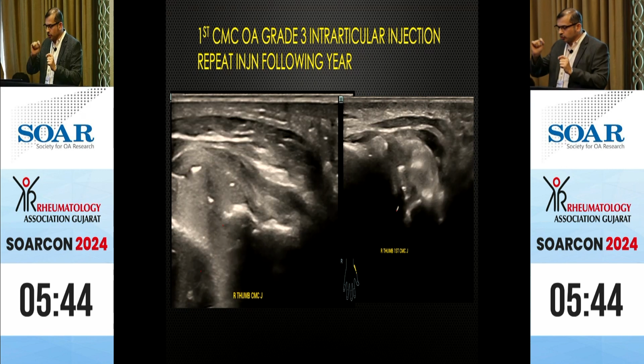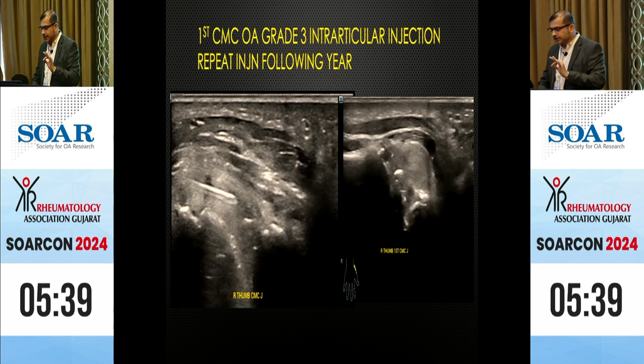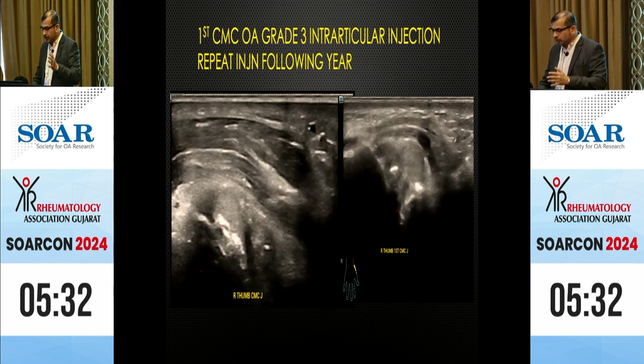You just roll your probe after removing the needle, flex and extend the thumb so that you can see the adequate spread of the dose into the joint, and you confirm that there is no extra-articular injection or any injury to any neurovascular structure.